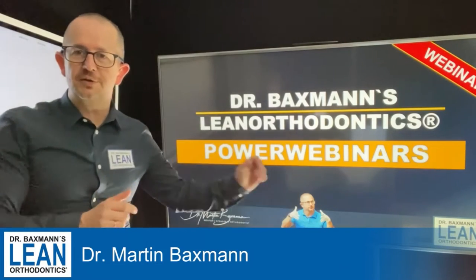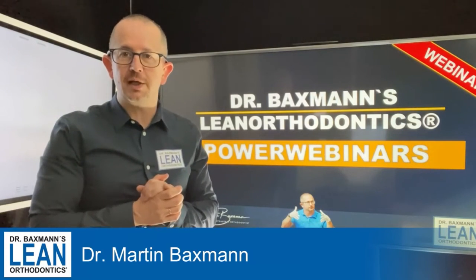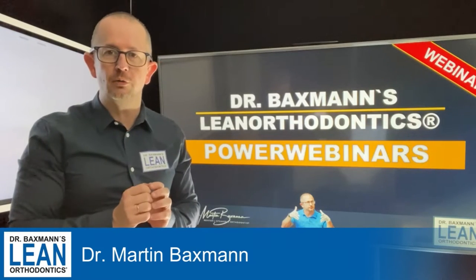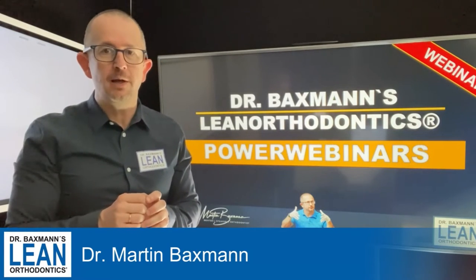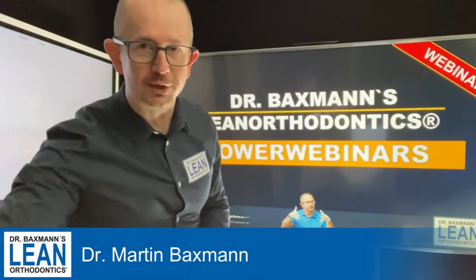Welcome to my Power Webinar Series in Lean Orthodontics. My name is Dr. Martin Baxman and today it's all about Lingual Orthodontics — how to fit a wire in Lingual Orthodontics. It's a bit fiddly, but if I can do it, you can do it too. And now let's get down to action.